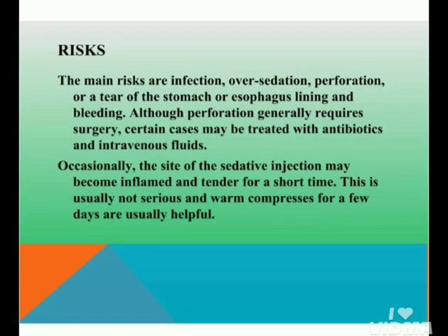Risks: the main risks are infection, over-sedation, perforation, or a tear of the stomach or esophagus lining, and bleeding. Although perforation generally requires surgery, certain cases may be treated with antibiotics and IV fluids. Occasionally, the site of the sedative injection may become inflamed and tender for a short time. This is usually not serious, and warm compresses for a few days are usually helpful.